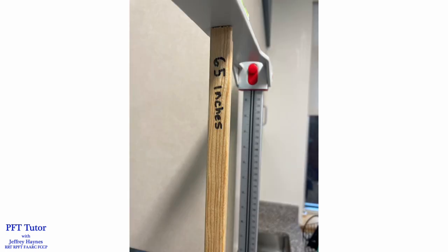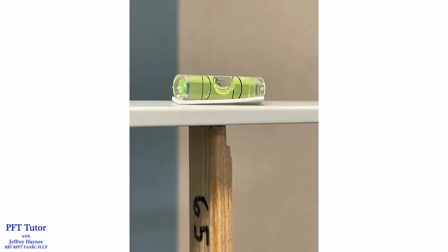We keep a measuring stick in our pulmonary function lab. You can go to any hardware store and just cut one yourself. Ours is 65 inches or 165 centimeters, and this is our standard for making sure that the stadiometer is accurate. So I will periodically test it to make sure it is accurate. Sometimes patients will question the accuracy of our stadiometer because they think they're taller than they really are, and you can just grab this and show them that the stadiometer is correct.